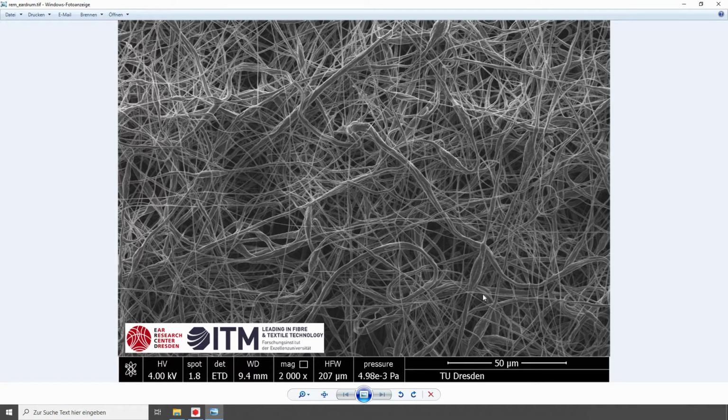We will first analyze this image and then we will generate a digital statistical twin. This will allow us to perform simulations for property calculations based on the identical statistical material properties. This helps us not only to test the existing material, but also to improve it.